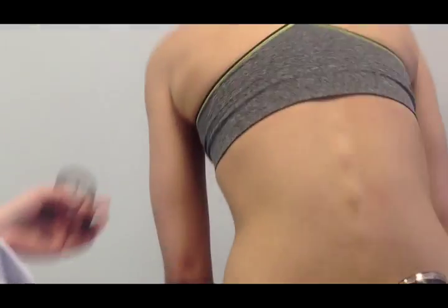You can go ahead and stand up, Mallory. Thank you. And that is how you use two inclinometers for lumbar rotation of the spine.